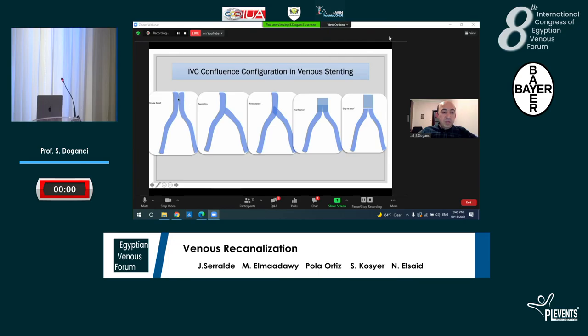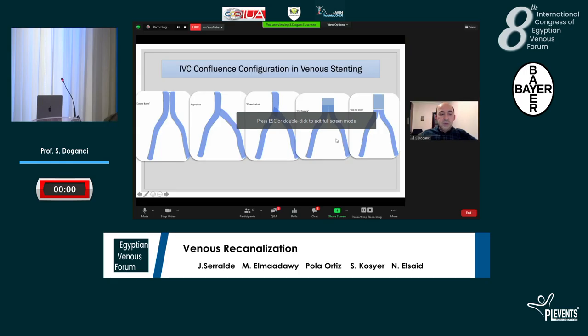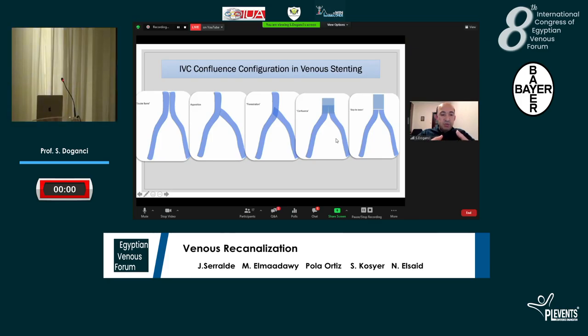When we look at the double barrel system, we know from the literature and from some experimental studies, especially for some types of double barrel stenting, when we analyze the animal studies, the metallic parts of the stent that touch each other do not get that much endothelialized, and they are not covered by endothelial cells, so those parts are still prone to thrombosis. That's why it's a bit difficult to have such configurations for the long-term data, and especially for the apposition.